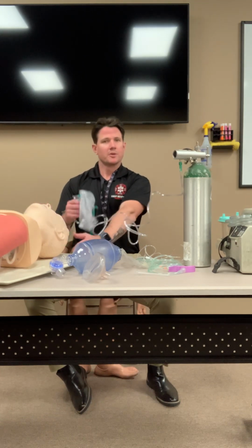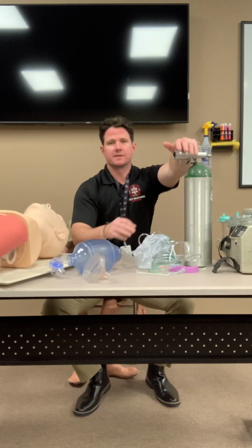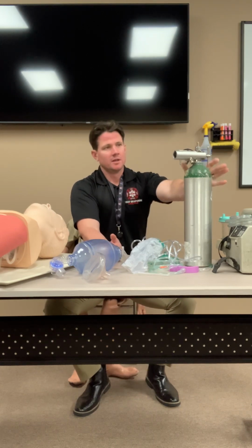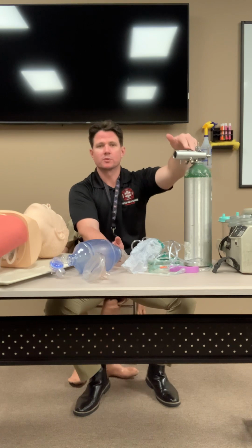So you're gonna take the non-rebreather off the patient, unhook your non-rebreather, and you can do a couple things at this time. You can shut off the flow meter, right? But you're gonna have to open it back up. So remember, as I stated when we spoke last time on Zoom, even when you shut this tank off, this is still pressurized, so we have to relieve the pressure.